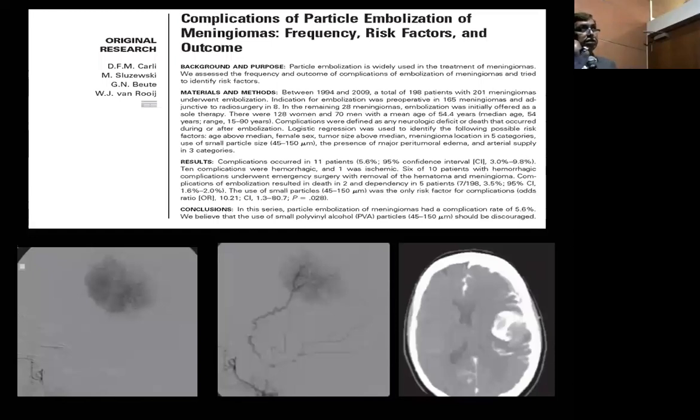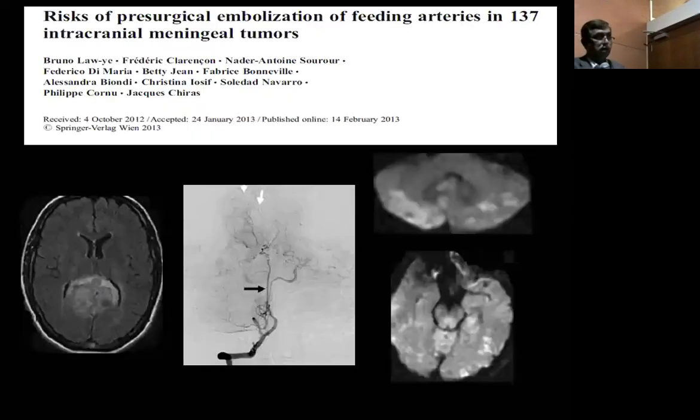Complications of particle embolization of meningioma. This is the blush, this is the embolization, and what did you get? Hemorrhage. Risks of presurgical embolization of feeding arteries.